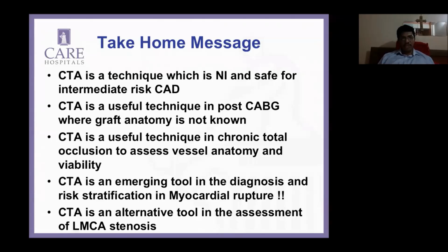So one of the missions that I have is to basically train cardiologists not to do, but to interpret CTs and to look for some of these abnormalities that we've been looking at, and not leave it to the discretion of where you send. Sometimes it's not under your control. I think it's very important to look at the data set yourself. And one of the missions I have is to spread this word across the country. So I'm glad that Sharat brought it up. Yeah, I can put my own personal experience in this regard.